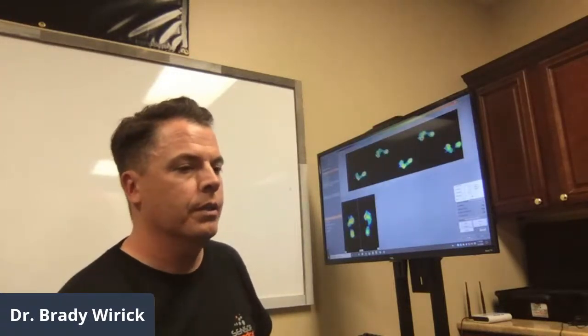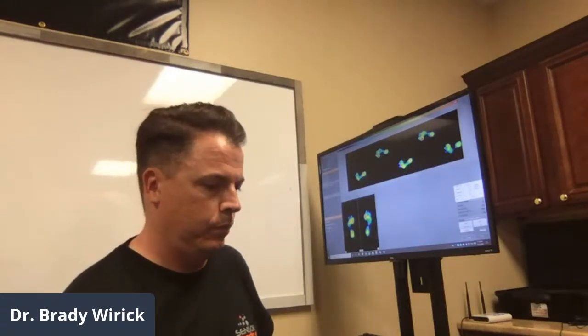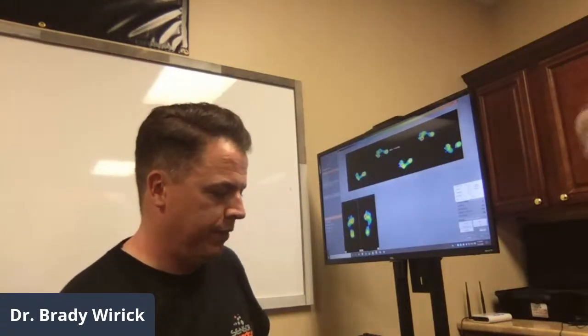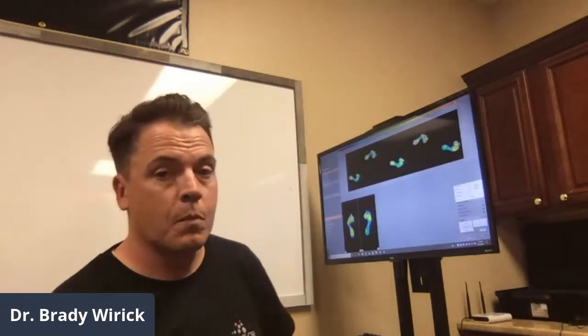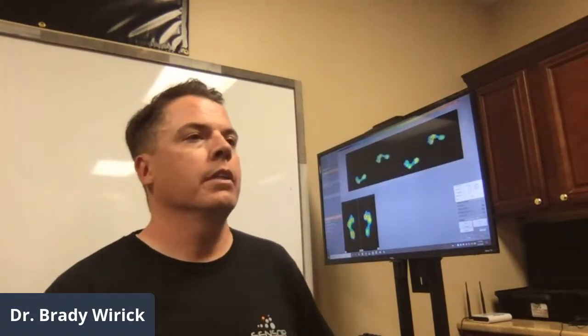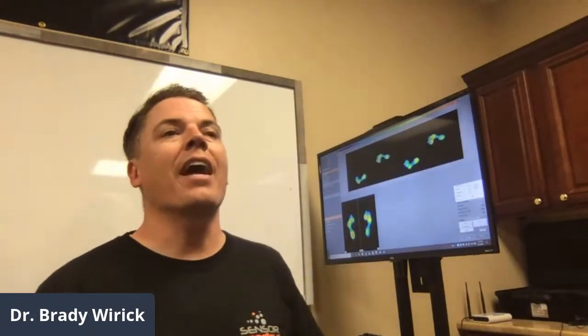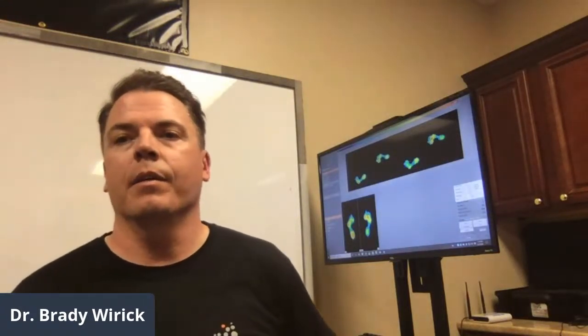We'll do 2 more, and then we'll call it a day. Perfect. Last one. You did good. So you can have your shoes and socks back, and then Sandra will get you scheduled. And just let me know how your hip did after today too.